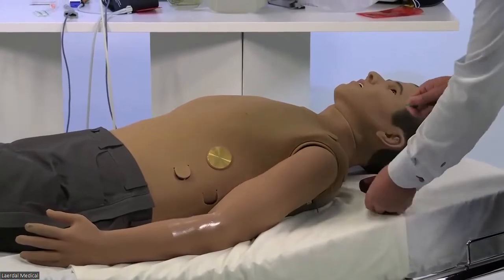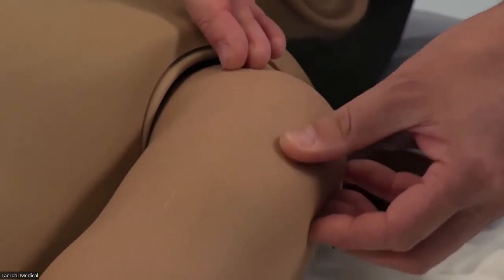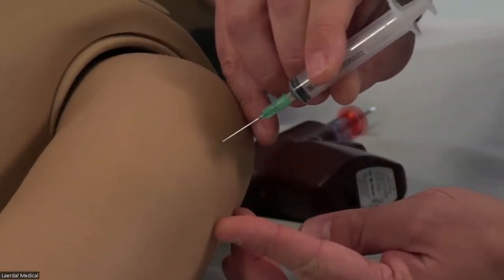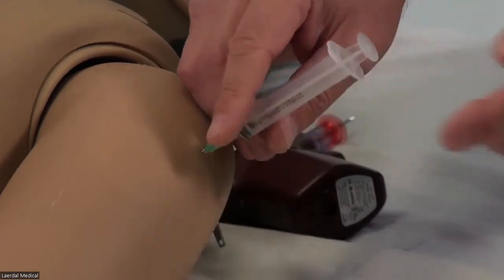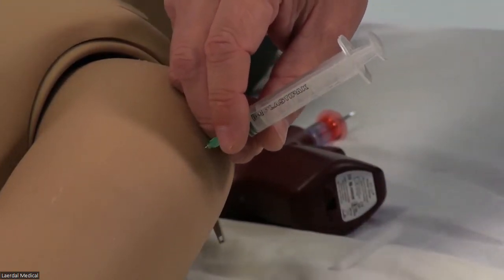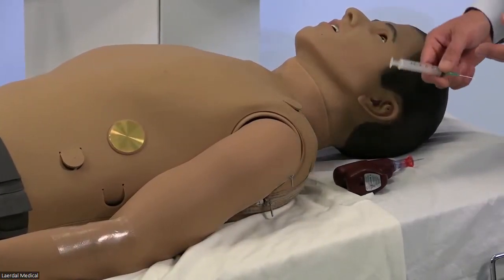As I mentioned, this whole area, you can feel the landmarks and you can kind of feel where the muscle is supposed to be. And you can insert here, and you can retract and insert fluids up to 10 to 15 milliliters. Then you can take out the pad, clean it, dry it, or replace it, and continue.